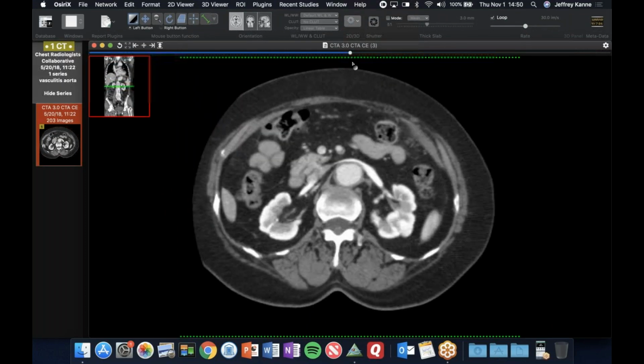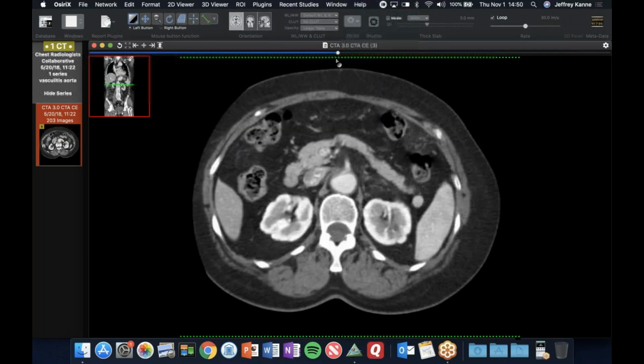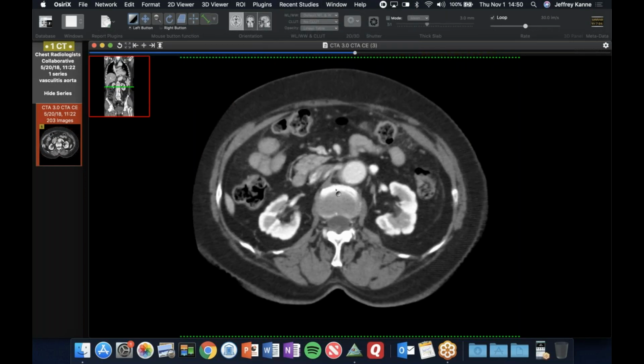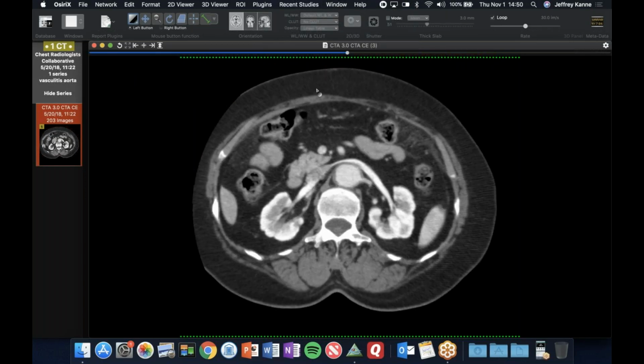She kind of has lobulated kidneys, probably old microvascular disease. I mean, if you look at her renal arteries, they're not involved. So none of the medium vessels are involved. It's really only... How old is she?